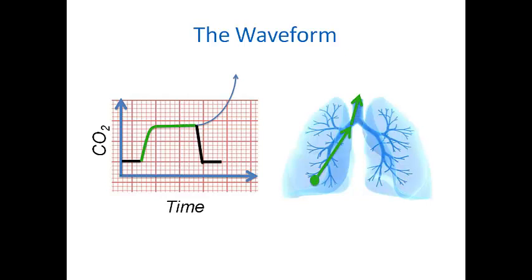The point at the end of the plateau, just before the wave goes back down towards baseline, is associated with our final end-tidal CO2 reading for that ventilation. As we move closer to baseline, the patient has now drawn air and gases back into their lungs and taken the measurement gas away from our measuring device and into the lungs as they oxygenate.